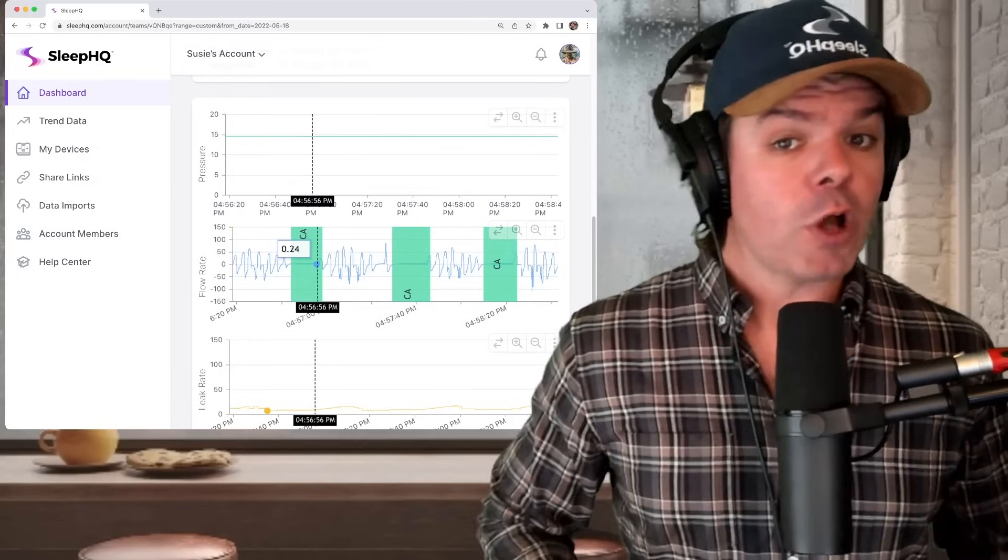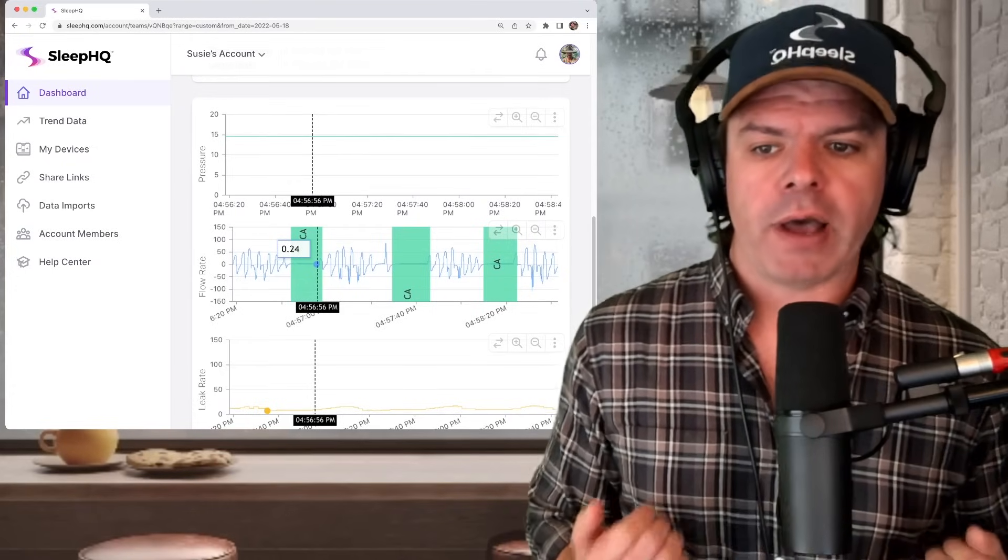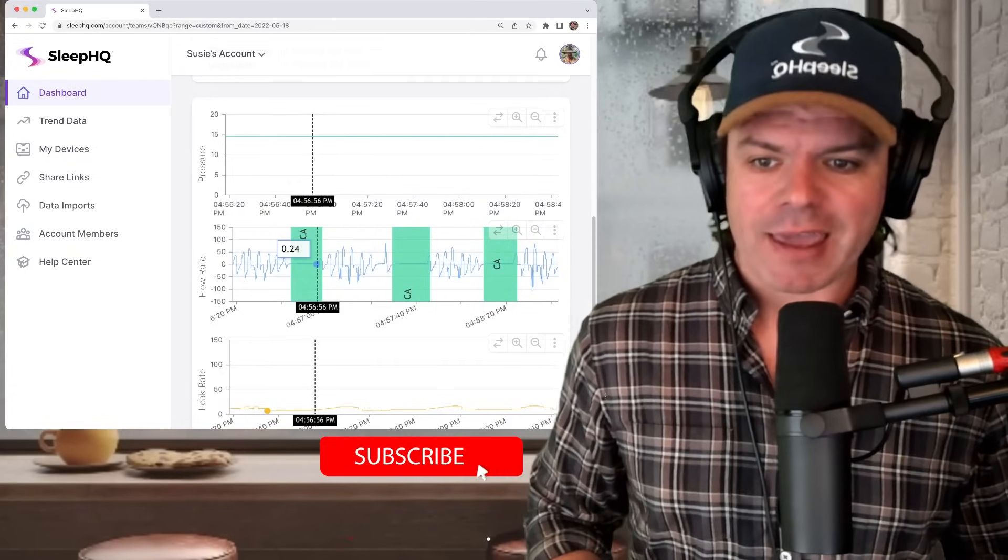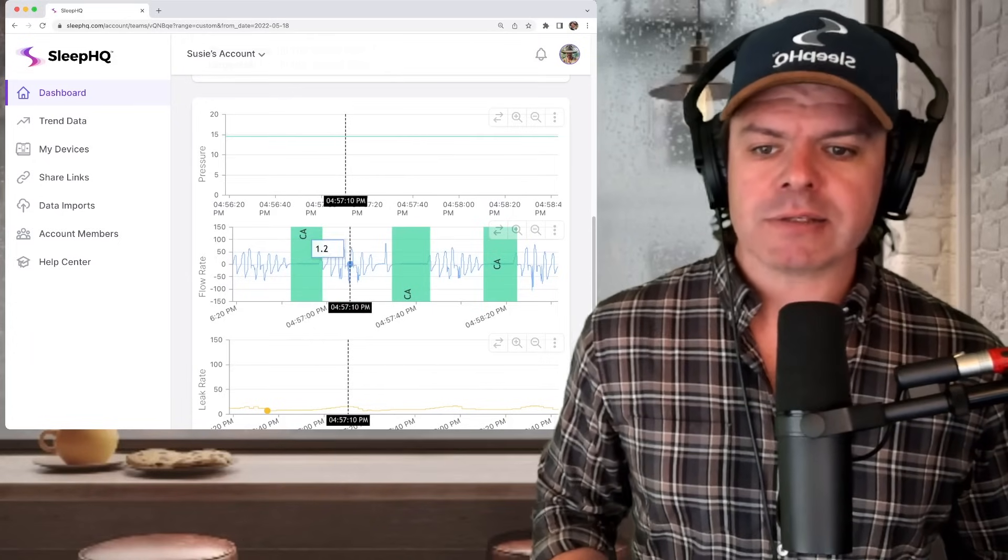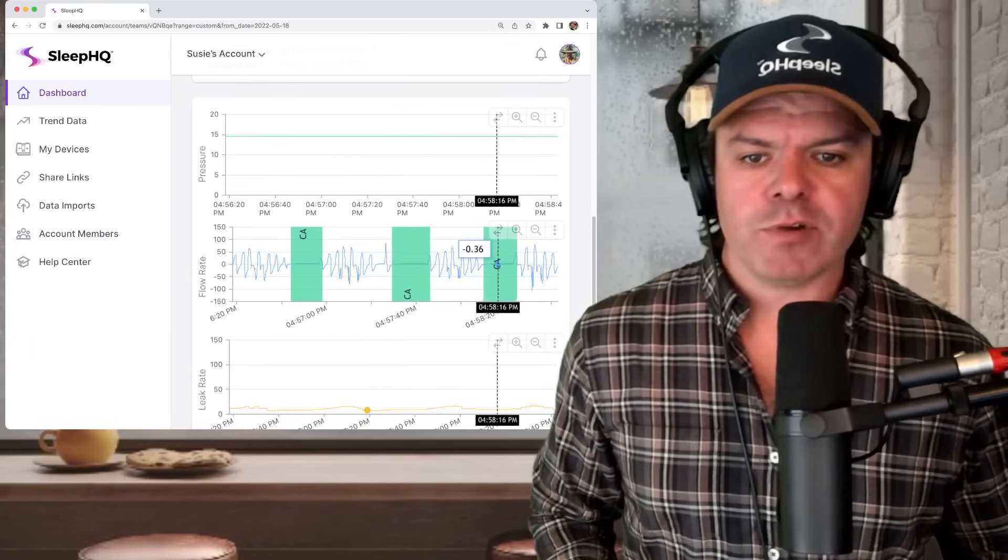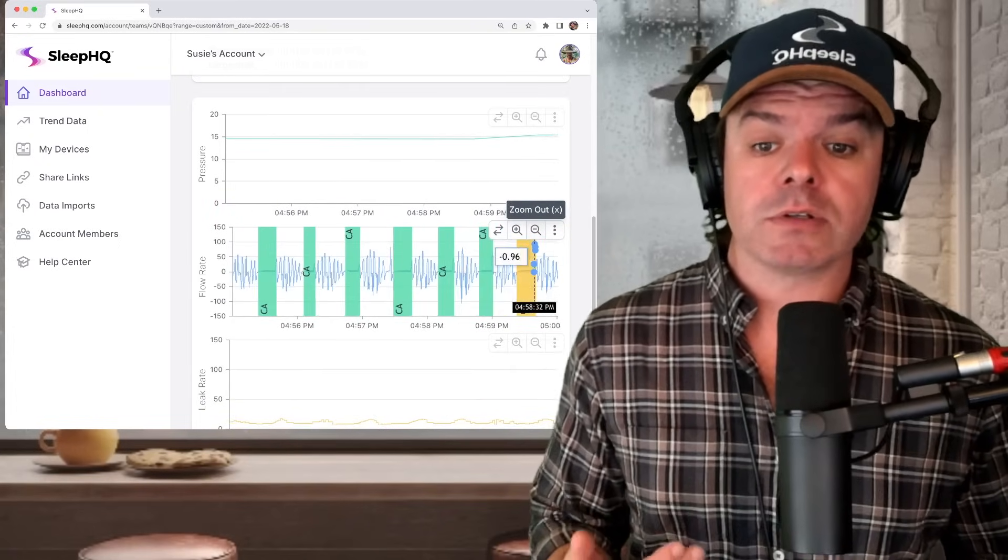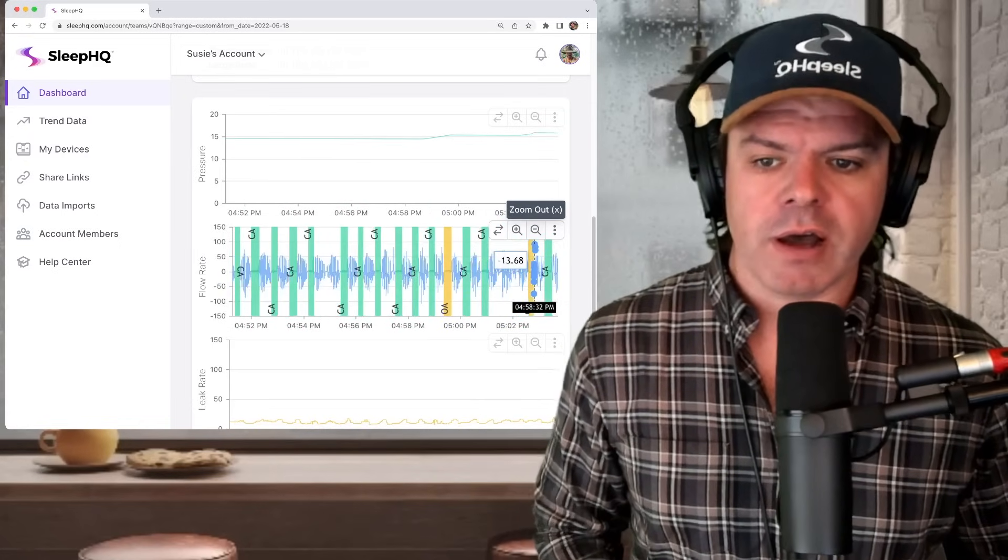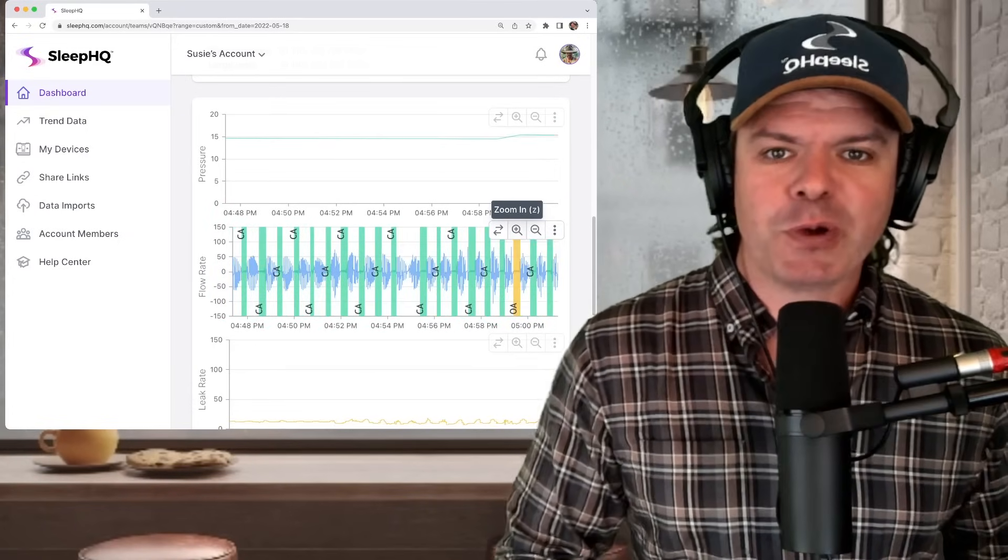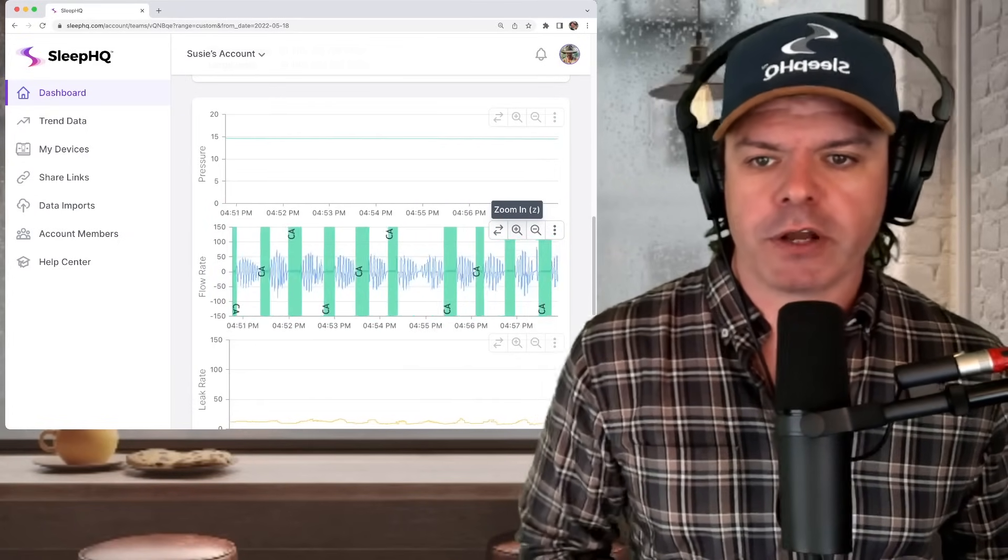And then the breathing just stops. It flat lines for about 20 seconds. There's no longer any airflow getting into or out of his lungs. And he starts breathing again, thank goodness. But then the cycle repeats itself. Look, it happens again here and here. And if we zoom out, you will see this pattern just repeating nonstop, hundreds of times through the night. Have a look how many events there are. Let's quickly zoom back in again, because there's one more thing I want to show you here.